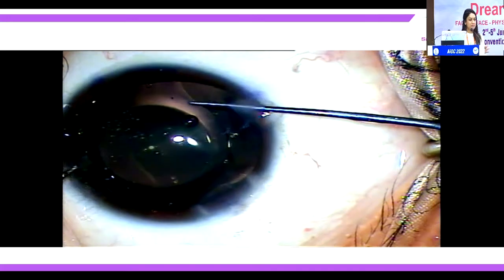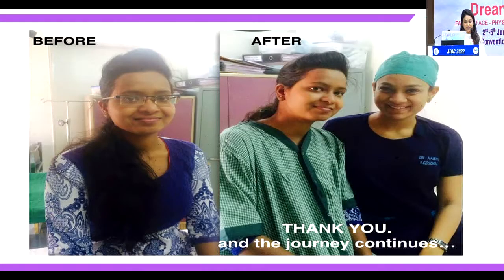Tucking is very simple. I'm not talking detail about it. So thank you. So this is actual patient back in 2016. She was very happy, and the journey of phakic lens does not conclude at just completing the surgery. It actually begins from there, where you have to actually check the patient post-op, vaulting, and IOP. Thank you. Thank you so much, Dr. Zain.